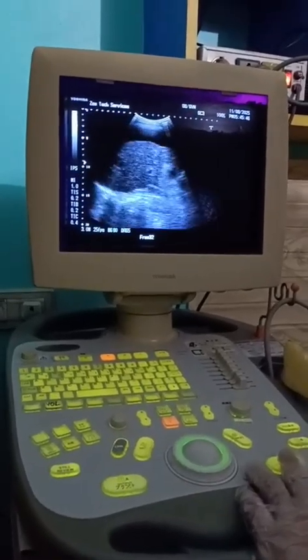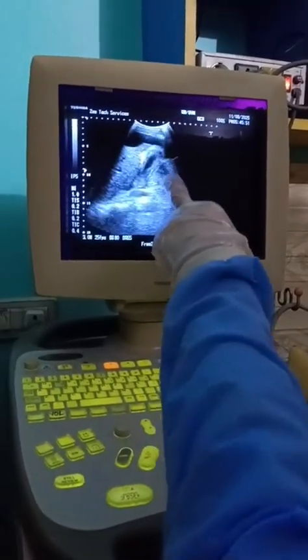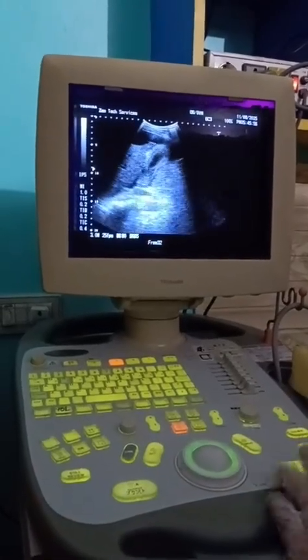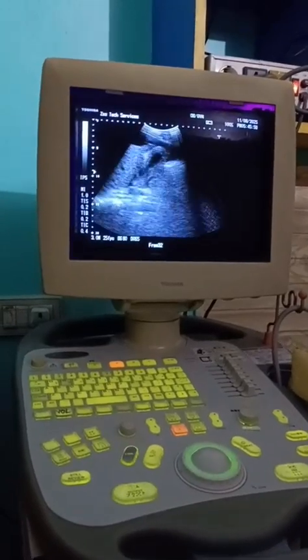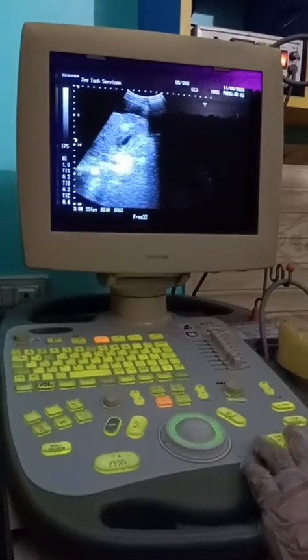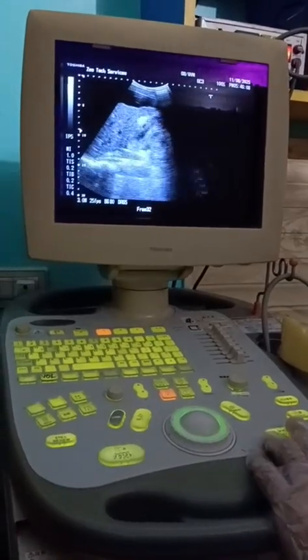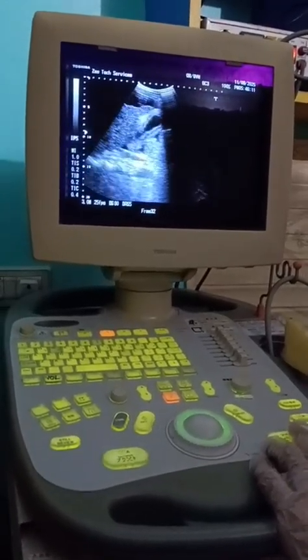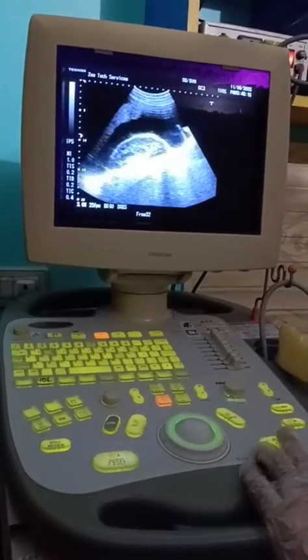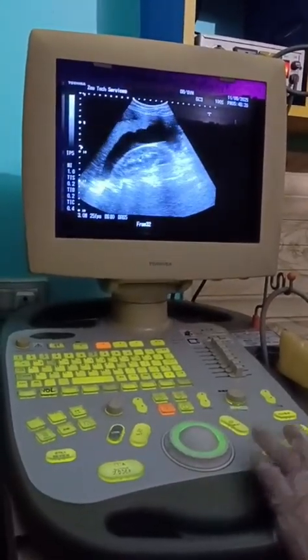So this is the liver, and the gallbladder is additionally thick-walled. You see here, this is the gallbladder. It shows a thick wall. It's not due to cholecystitis, but usually due to reaction, because there is massive free fluid around it, as well as edema and liver infection. So due to these reasons, the gallbladder wall is thickened. Do not be confused with a thick-walled gallbladder in cases of cirrhosis of the liver or when there is fluid.